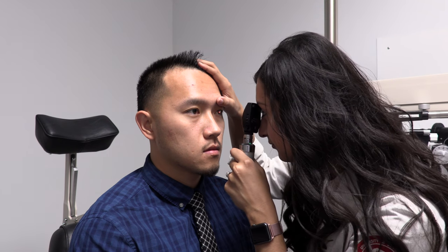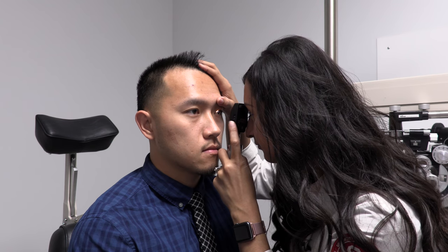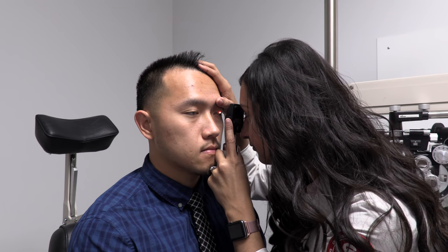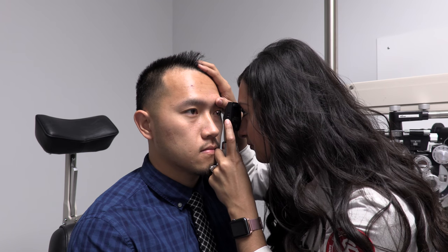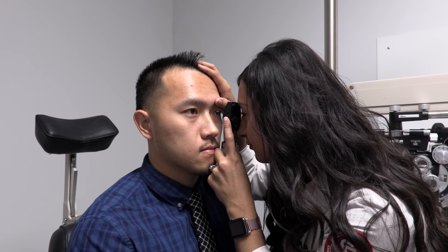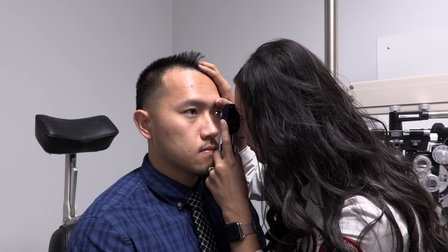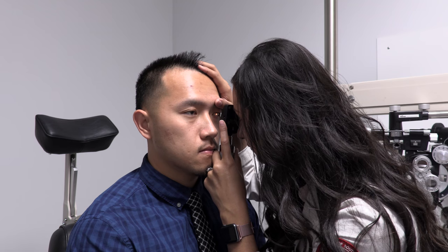Now that you're in position, look for the red reflex. Get closer until you have the optic nerve in sight. You can change the diopter settings to focus on the optic nerve. Once you see the optic nerve, look at the cup to disc ratio. You can move slightly up or down to look at the vessels. Move temporally to look at the macula and the fovea.